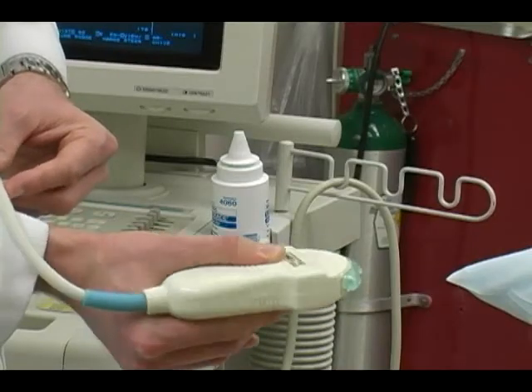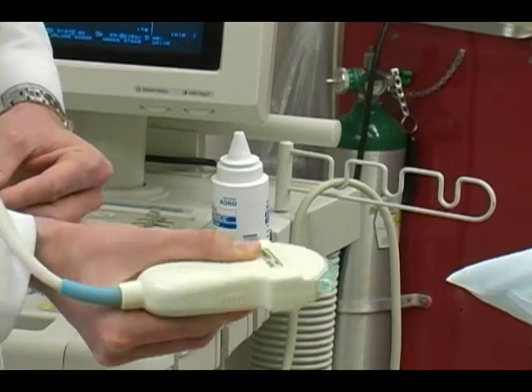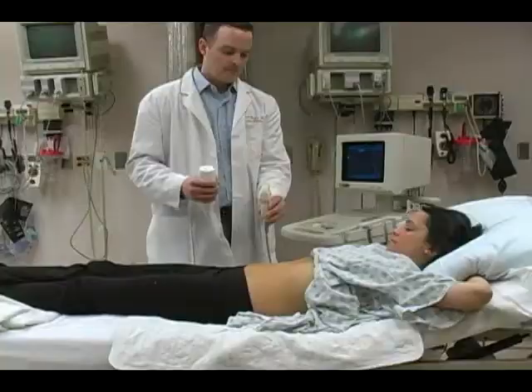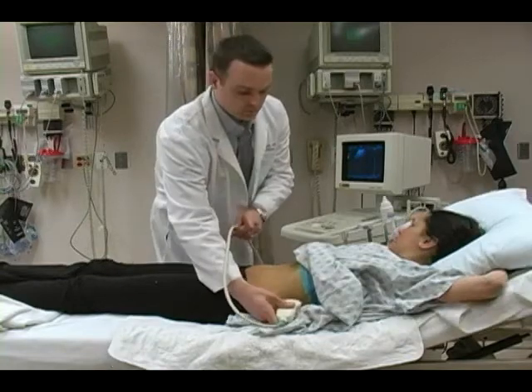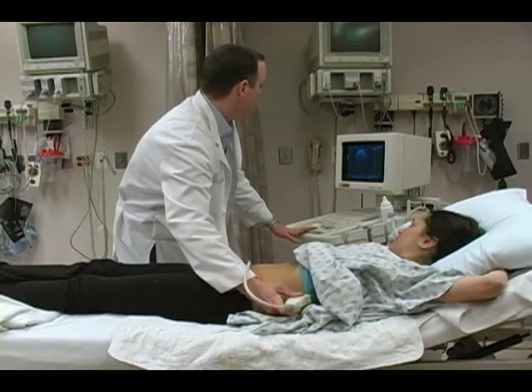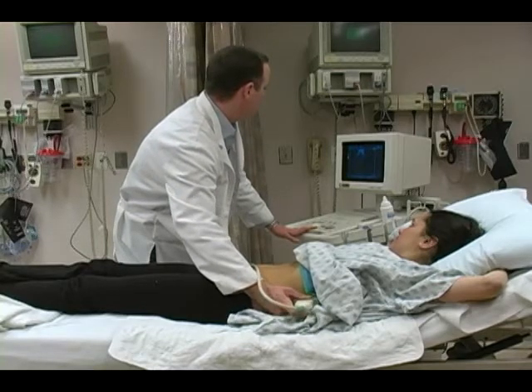In general, you should hold the ultrasound probe as you would a pencil, with the probe secured lightly between the thumb and forefinger. When imaging a patient, be sure to apply appropriate conductive gel on the probe surface and gently place the probe on the patient in the proper orientation depending on the exam type.